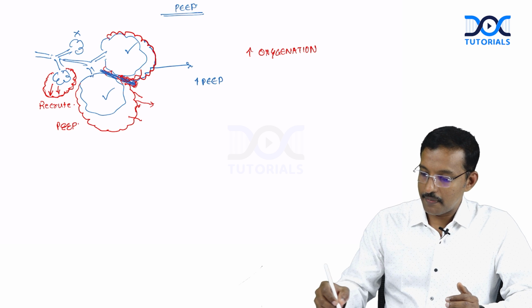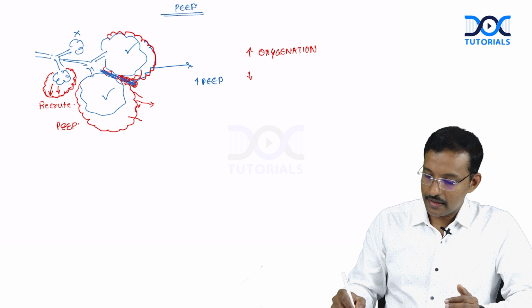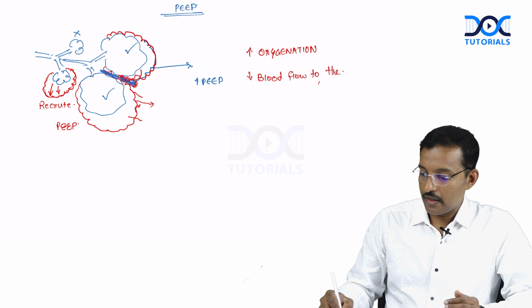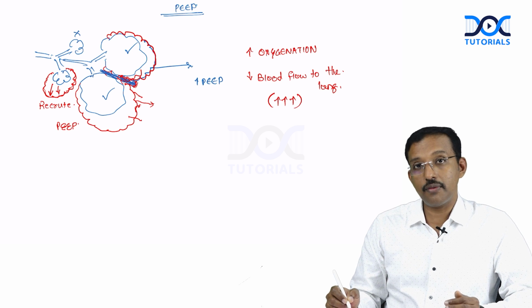It can improve oxygenation, increases the oxygen, but at the same time it can cause some problems like reduction in the blood flow to the lung if it is exceeding more than what is needed.